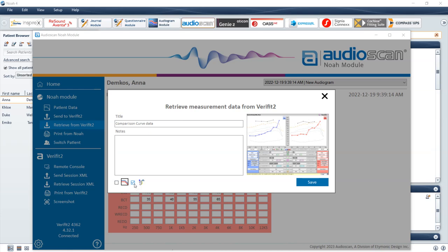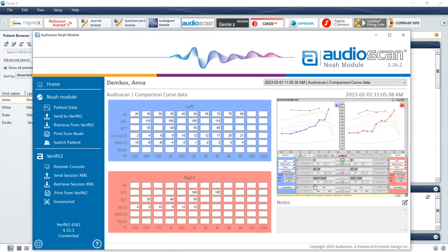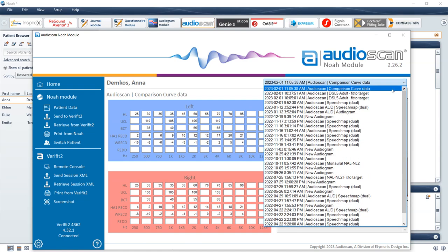If desired, select the X to exit the data retrieval pop-up screen and return to the previous screen. Select the Save button to complete the retrieval of data from the AudioScan equipment. The stored data will be accessible from the Client Session Data drop-down and will be labeled according to the date, time, and title at time of storage.